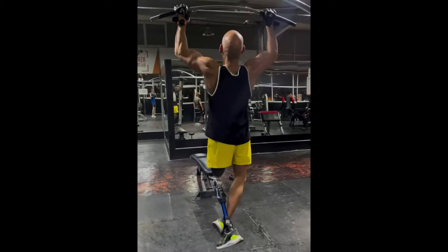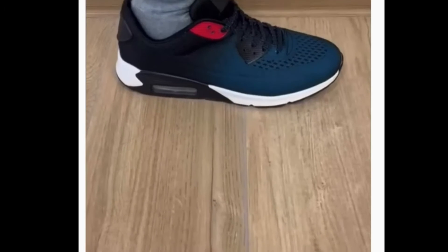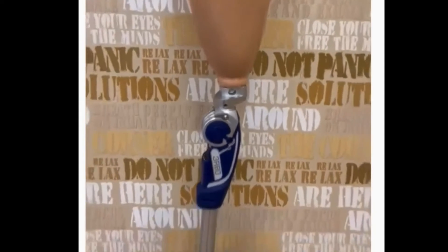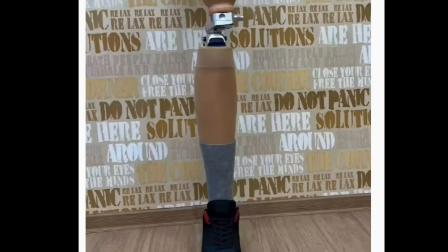A reliable and durable solution for active patients, the unit is waterproof for both fresh and salt water and features a manual lock for added security. Assembly and adjustment are easily carried out in the following order: assembly of the prosthesis, static adjustment, dynamic fitting.